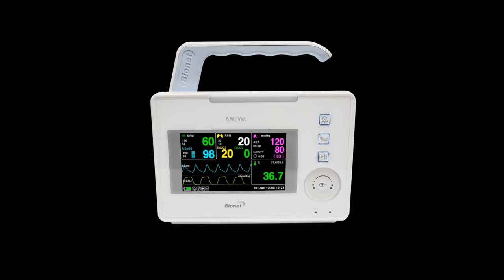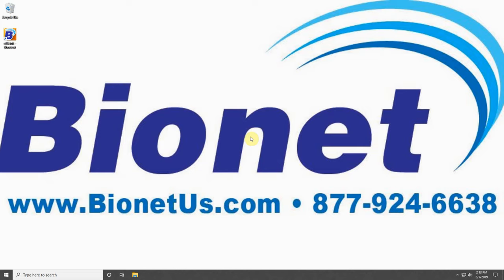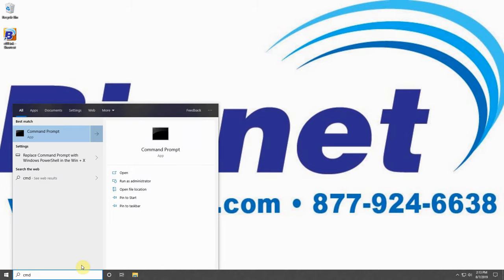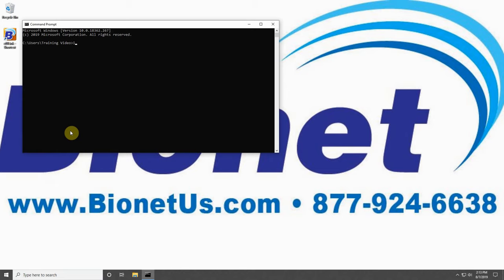The two primary patient monitors that will connect with B-Link are the BM1 VET and the BM5 VET. For both of these machines, you will need to first obtain your computer's IP address. Start by typing CMD into the search bar or Cortana, and click on the Command Prompt link that appears. Type IPCONFIG as you see it on the screen and press Enter. The IPv4 number is your computer's IP address — write this number down, as you will need it later.